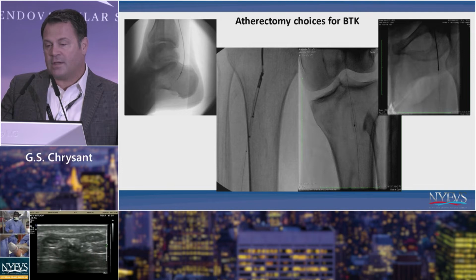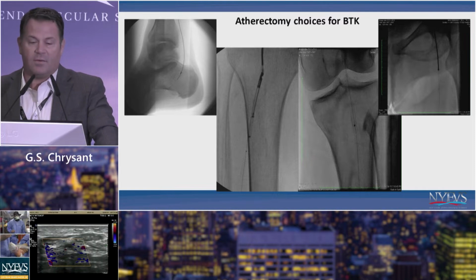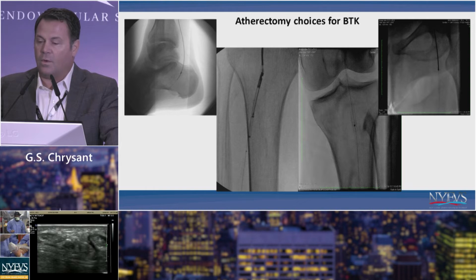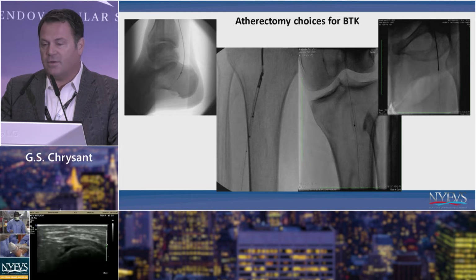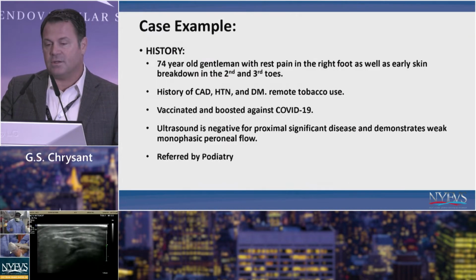In terms of atherectomy, some devices have more data than others. I think this is personal preference and skill set, whatever you feel comfortable with, whether it's directional, laser, orbital, or rotational, and I think it's case specific. Obviously, I don't think one size fits all in these sorts of lesions and in this sort of disease.